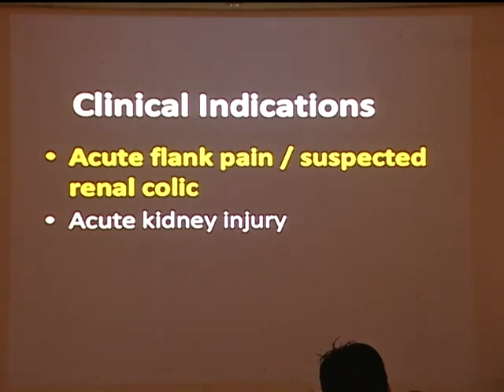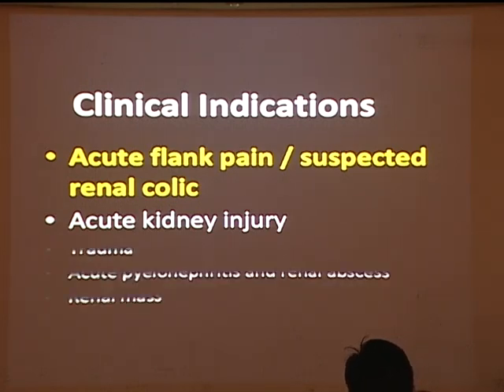And the second indication may be acute kidney injury, since the post-renal cause, bladder obstruction or urine retention, is the leading cause of acute kidney injury. So you can see this by ultrasound.